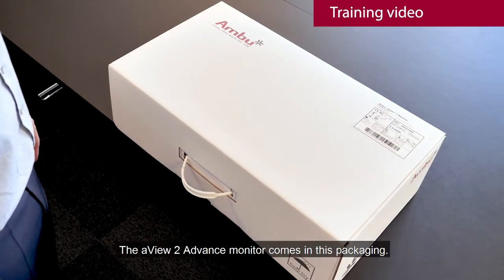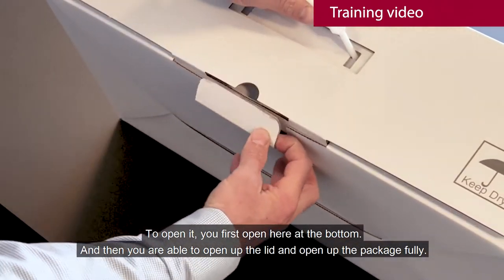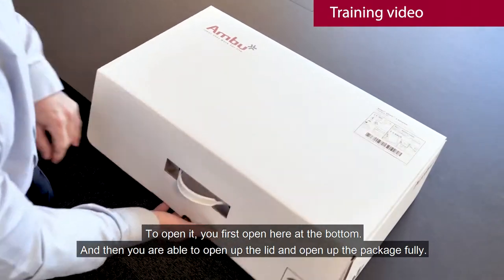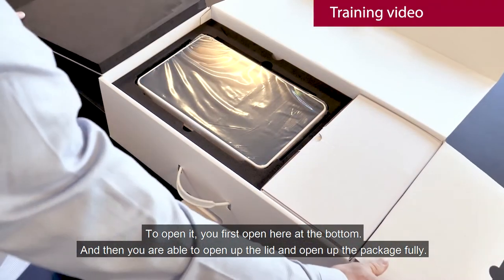The aView 2 Advance monitor comes in this packaging. To open it, you first open here at the bottom, and then you are able to open up the lid and open up the package fully.